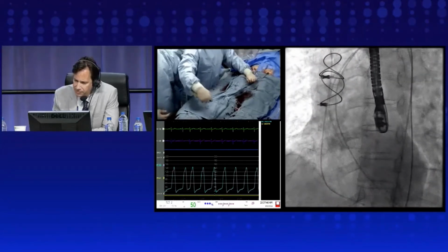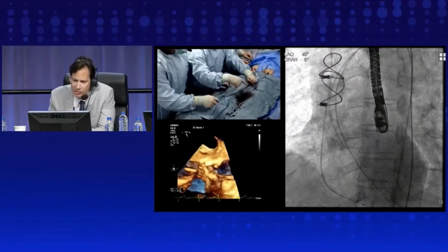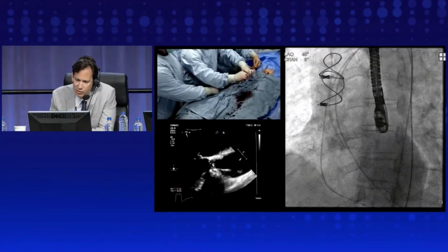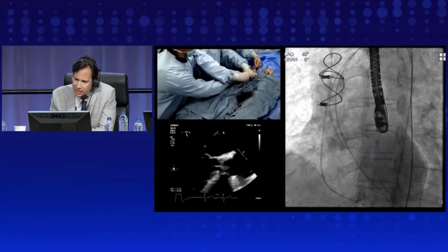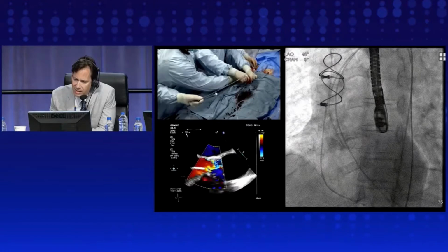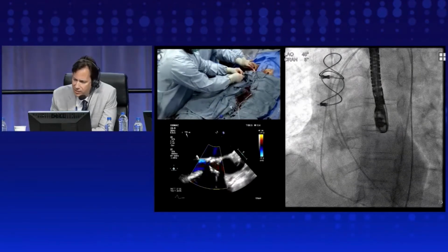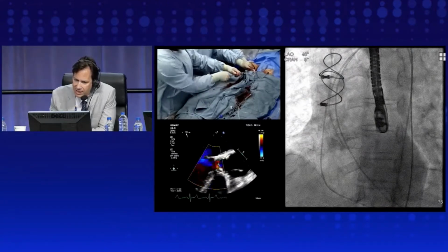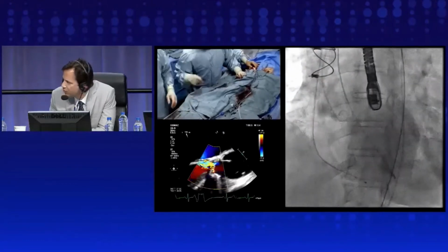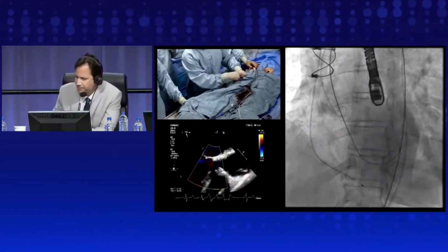And Vasilis, what is the dextrose accomplishing when you're injecting it? Can you speak to that? Yeah, the dextrose displaces all the salt so that you can send all the energy and not have it disperse, all of it to what we call the flying V. That's the bend that you saw Danny make, where he denudes just the inside of it. So it's a wonderful trick because you can burn indefinitely without creating char on the wire, and it's definitely part of the secret sauce of burning.